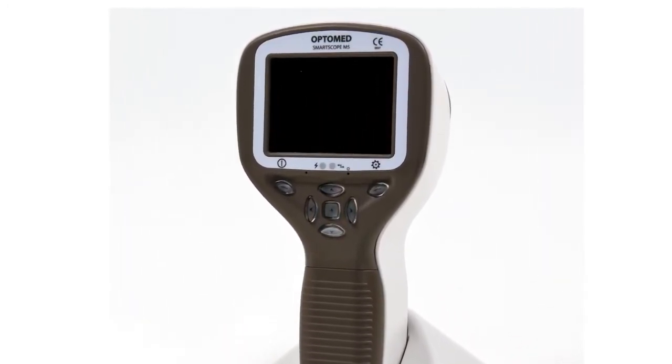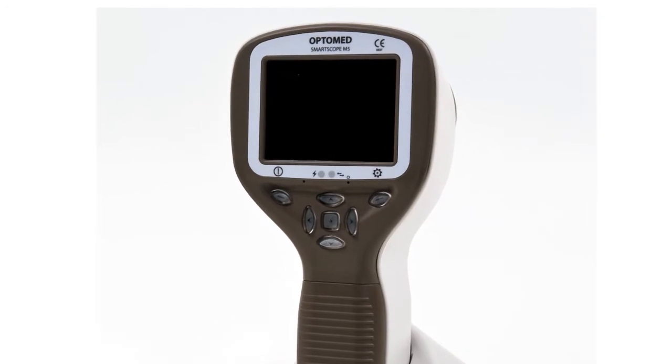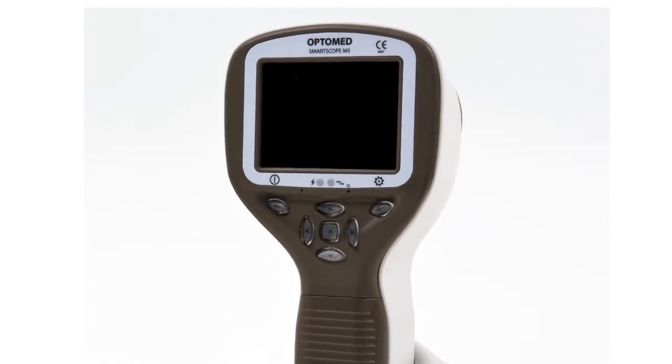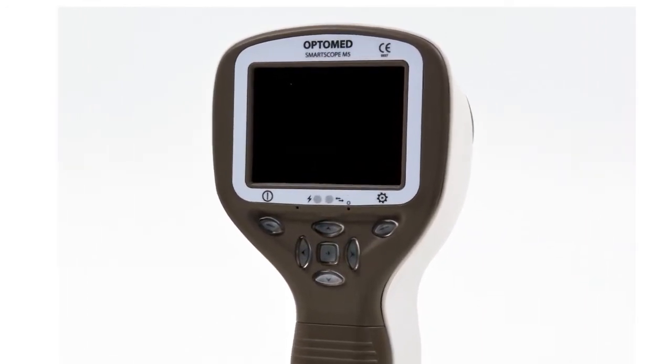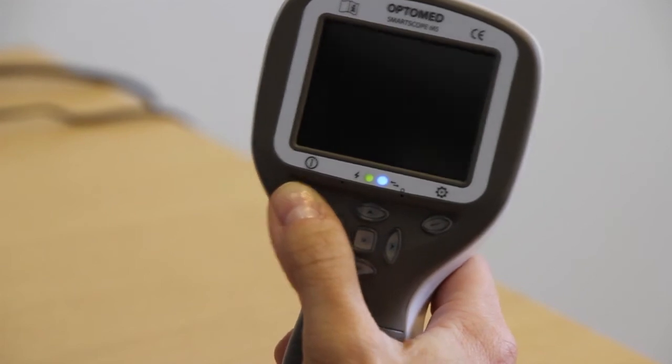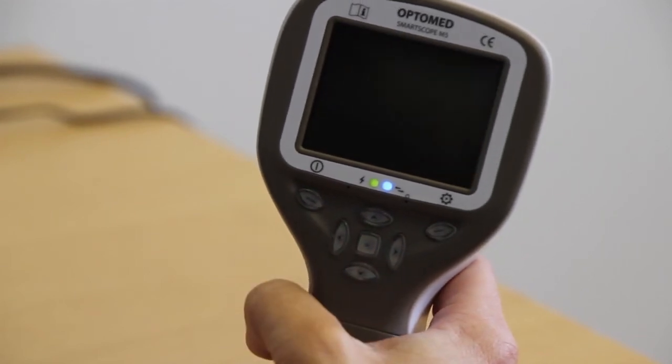First, let's go through the basic use and settings of the device. Power on and off the device using the left soft key.